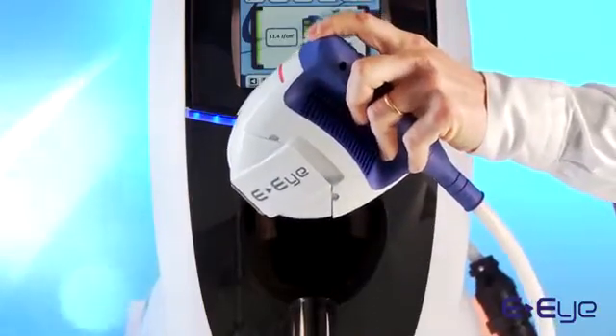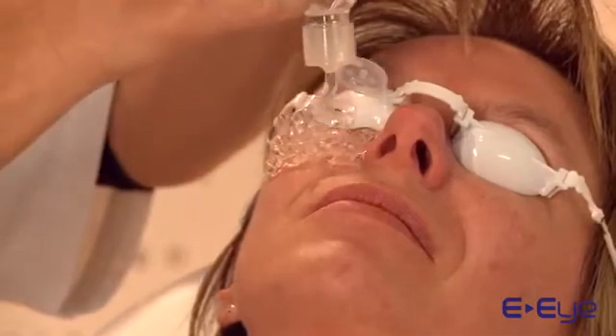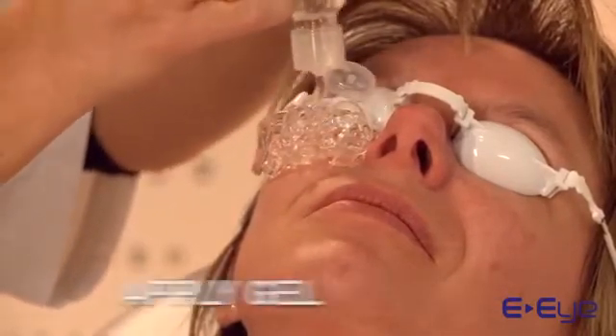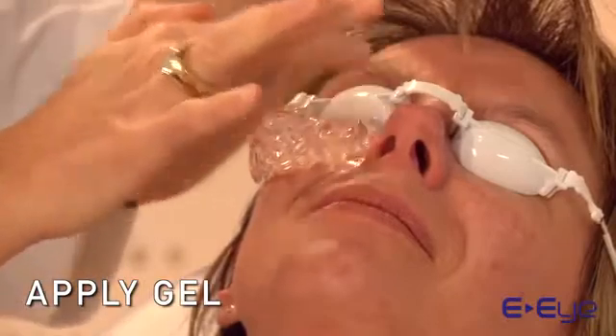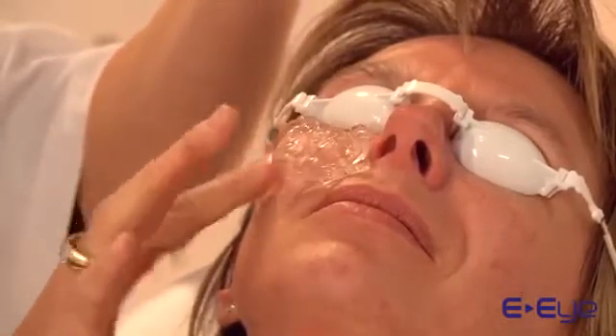Press the start button to trigger a flash. Once the eye mask is positioned on your patient's eyes, apply a thick layer of gel over the entire area to be flashed — that is from the edge of the nose up to the temple. The gel should be at least one centimeter thick.